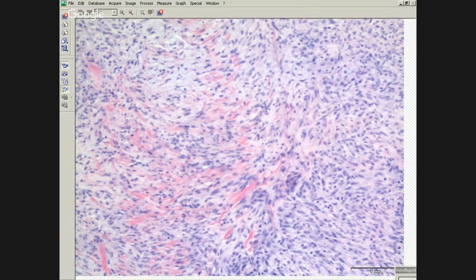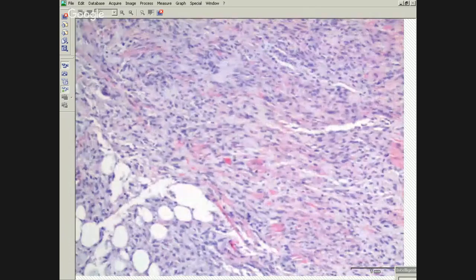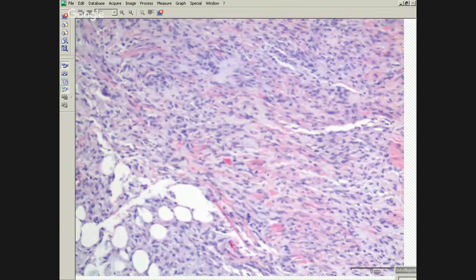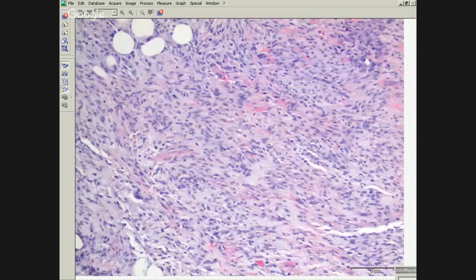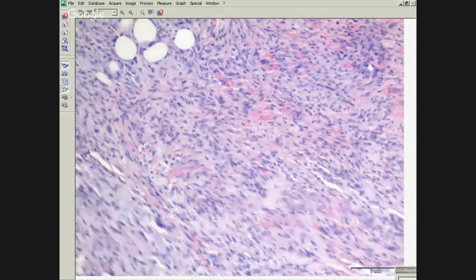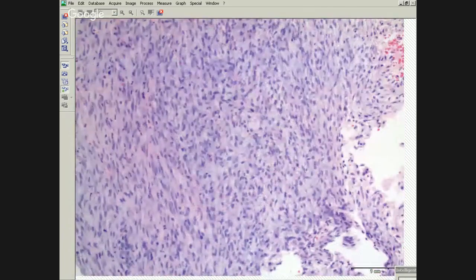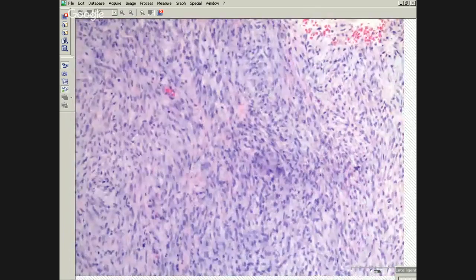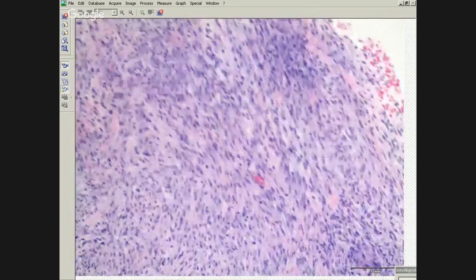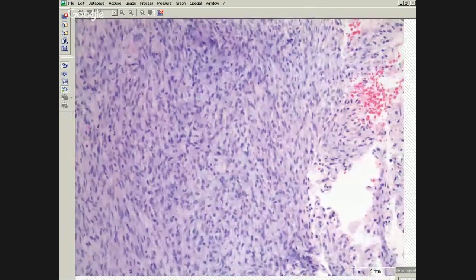Spindle melanoma going to the pleura, we don't see that very often. More often it's going to be your conventional, more epithelioid type melanoma when it's in the pleura. So this one took a few rounds of immunos to sort out, plus the clinician being like, oh, by the way, she did have a history of melanoma.